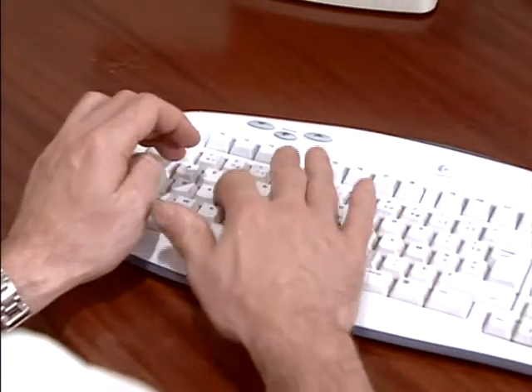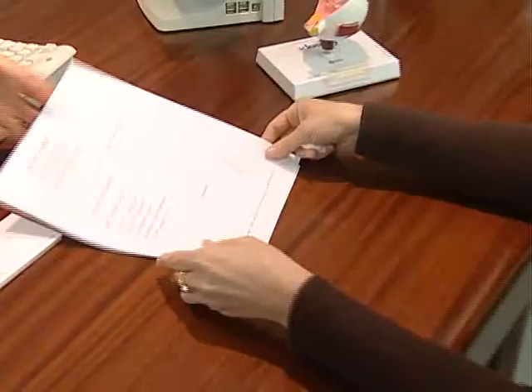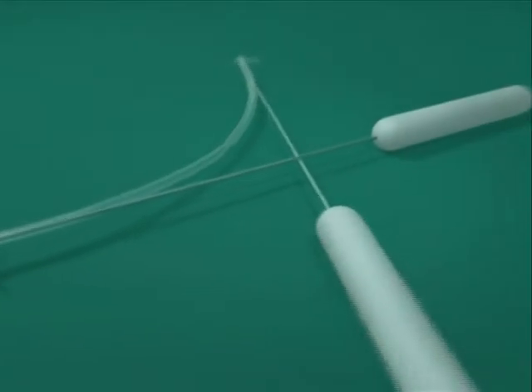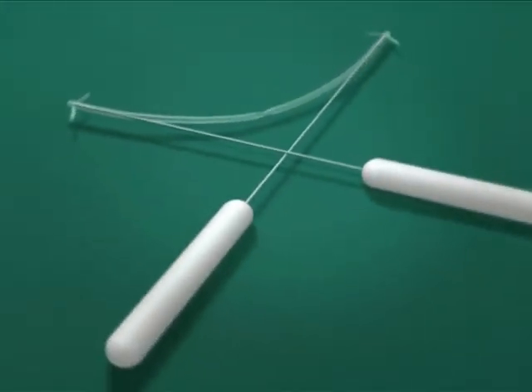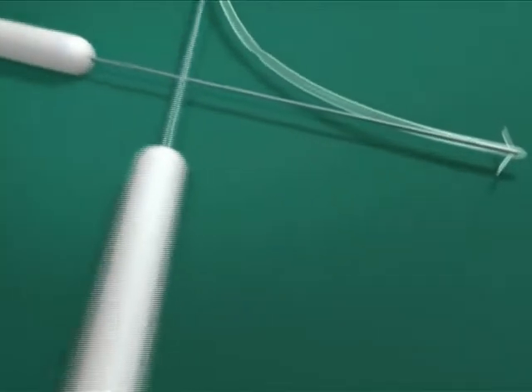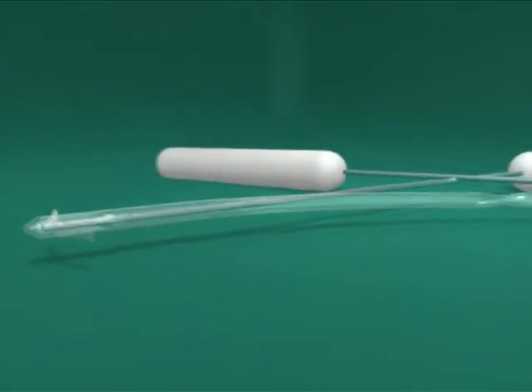We tell our patients that they may experience ocular irritation for a few days after the insertion. We advise them to avoid pulling on their eyelids when instilling the eye drops, not to touch their eyes, and to wear a patch or a dressing for the first few nights. We believe that using the autostable bicanaliculus intubation set 2 to treat tearing is attractive for the ophthalmologist, as it is simple to insert, and appealing for patients, since it can be fitted in the consulting room.